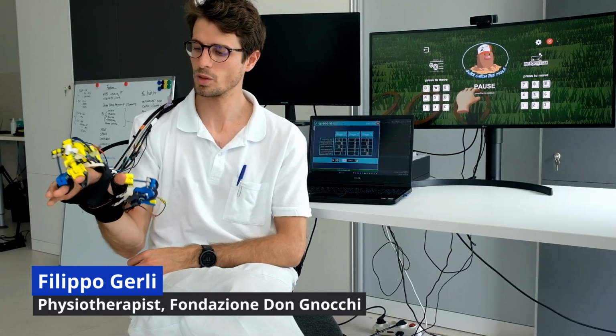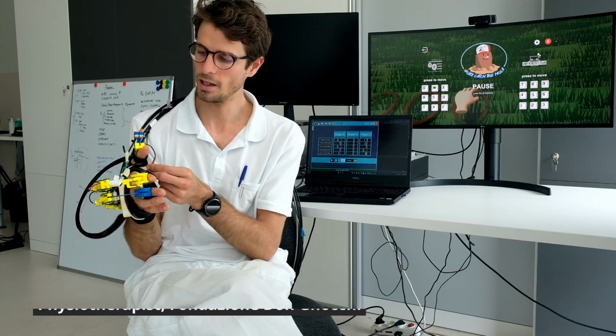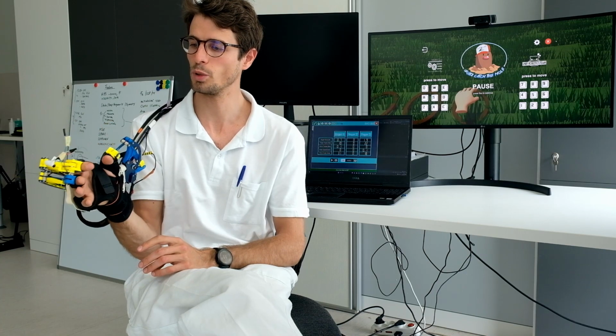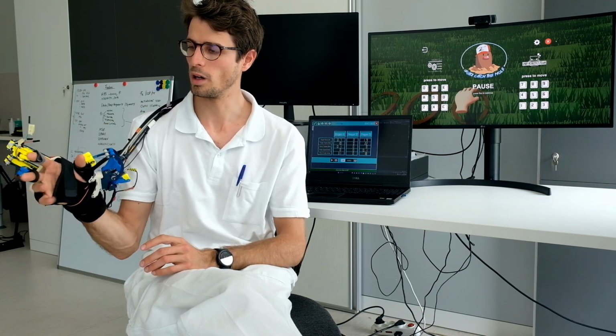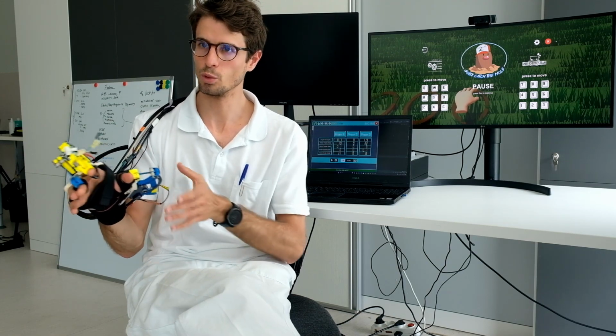An innovative aspect of HES is the ability to use the thumb in a fluid way. The ability to oppose the thumb in a natural way means being able to perform different grasps. It is very difficult to mimic this ability with a robotic mechanism.